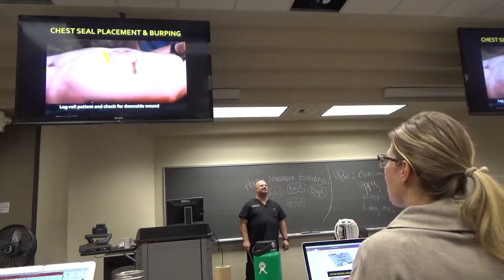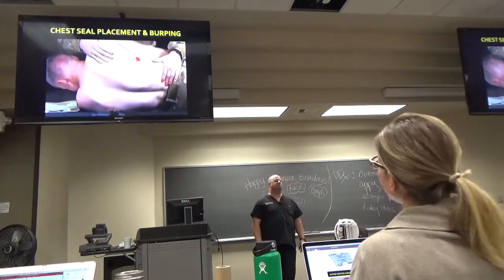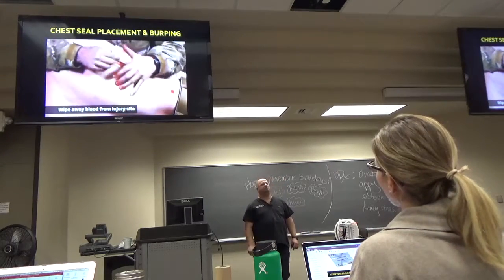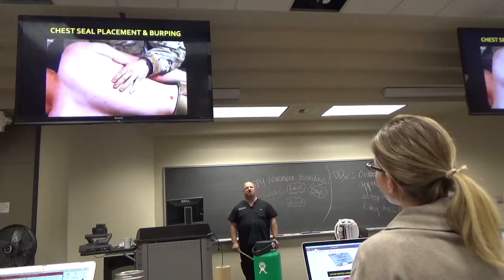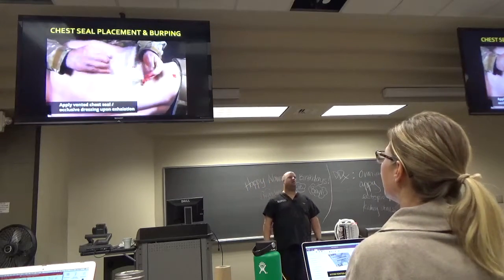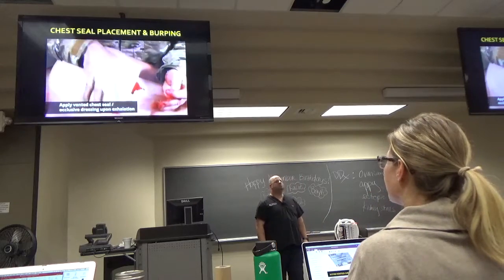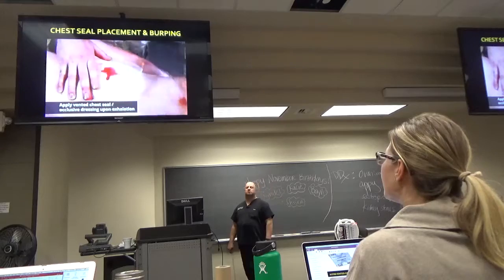be sure to log roll your patient and check for an exit wound. Inspect the exit injury, wipe the area clean, and apply an occlusive dressing. Got to expose the patient. For demonstration purposes, I'm going to be applying the occlusive dressing on the exit injury. And again, apply upon exhalation.